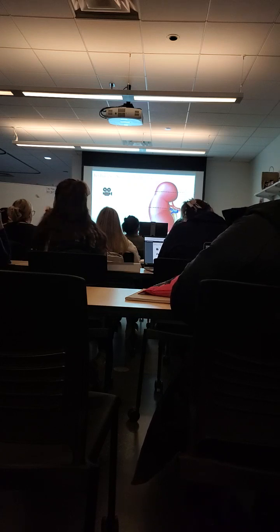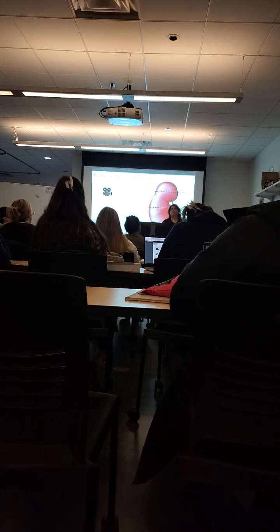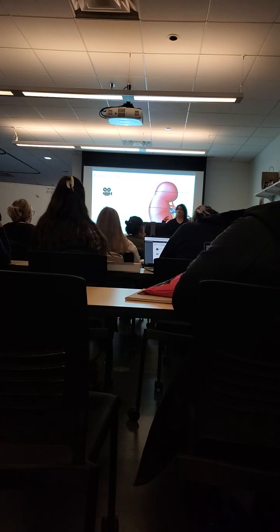Why do we do a movie, or this recording, for the kidneys, but why can't we do it for the liver too? Good question. We always do it for kidneys, no matter what. Liver, if they have cirrhosis, or if you find something in the liver, then you do a cine of the liver. But if the liver is healthy, happy, there's no need to waste your time doing a cine. But the doctors want to make sure that we get a cine of the kidneys and still images because they want to make sure he didn't miss anything. That's how important renal carcinoma is.